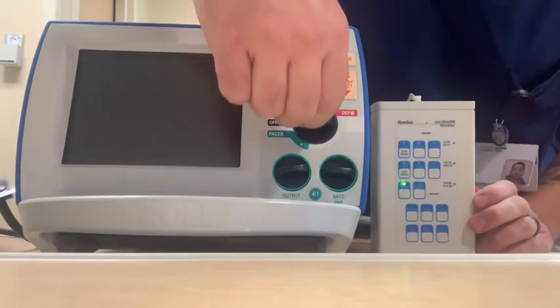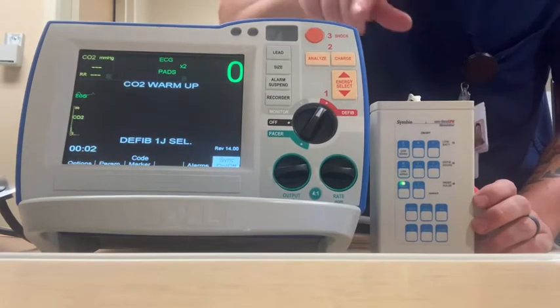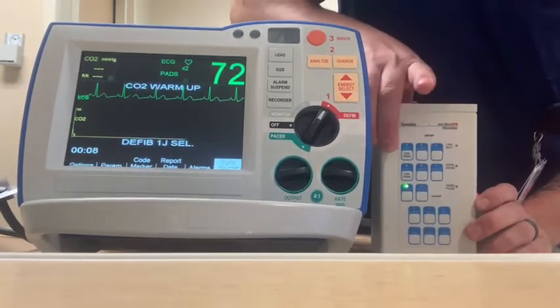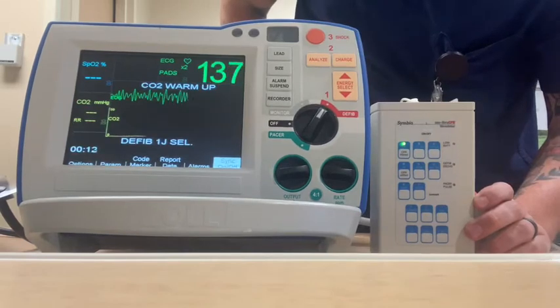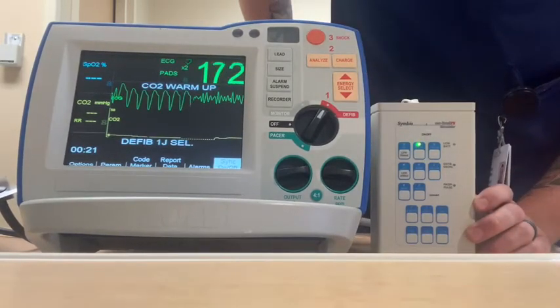What I'm going to do is turn on the defibrillator to defibrillate. And what I'm seeing there is whatever I select here on my module. So if I wanted to see some VFib, I can press VFib, and VFib shows on there. If I wanted to see VTAC, there's some VTAC.